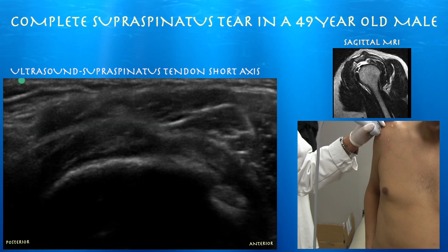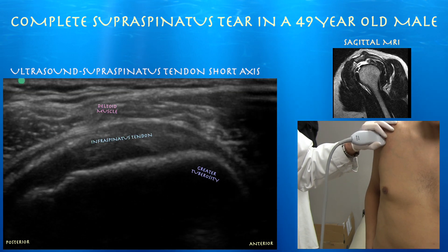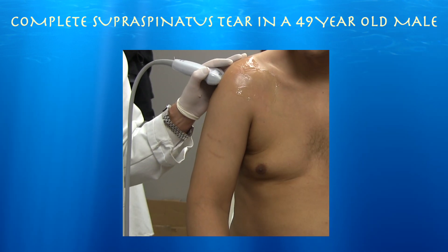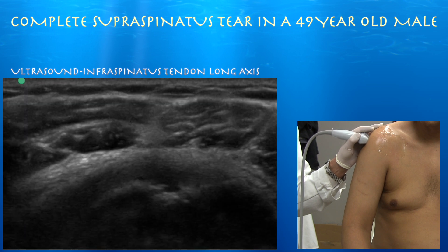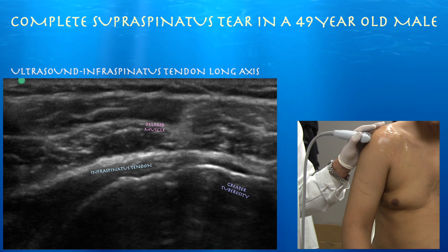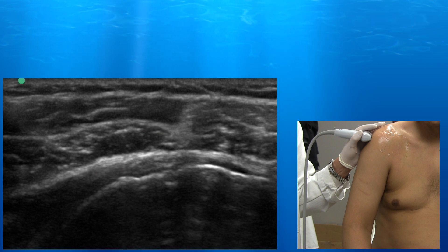We're getting to some of the infraspinatus tendon, and as you go posteriorly you can see the infraspinatus tendon. Here's the infraspinatus muscle and tendon — you can see it inserting on the greater tuberosity. It looks preserved, and here the infraspinatus again is intact. So really just a complete tear of the supraspinatus.